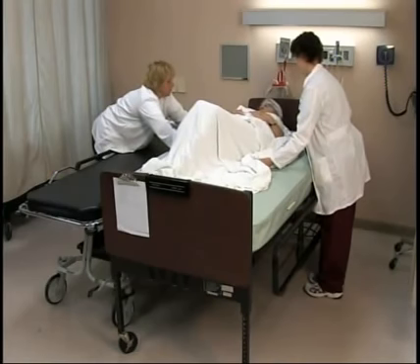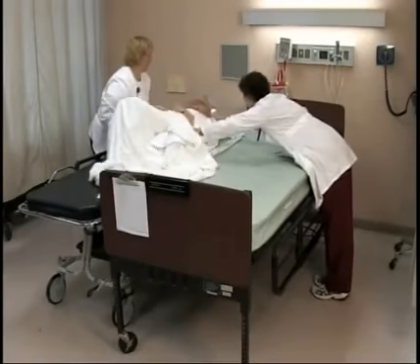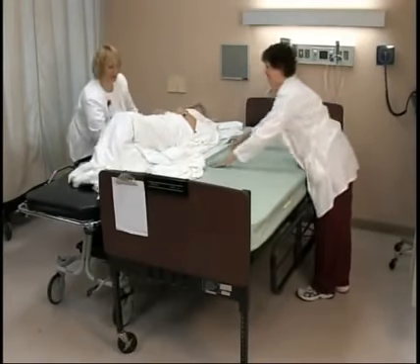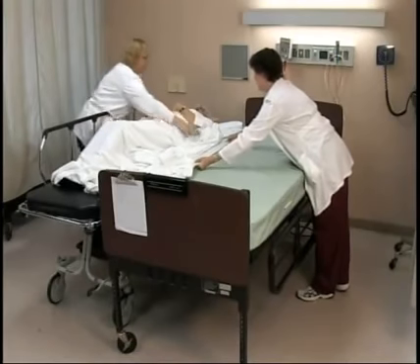Instruct the patient that you will slide them over on the count of 3. 1, 2, 3, and slide them over. Instruct the patient to move their chin to their chest. Once the patient is transferred over, leave the transfer board on the patient's bed.